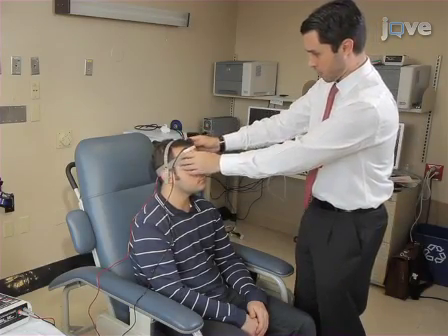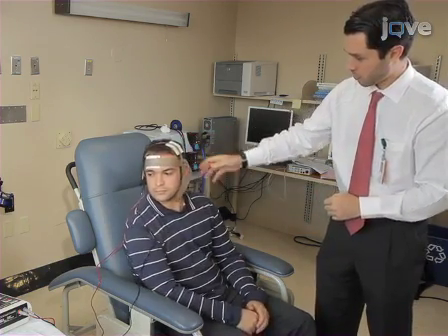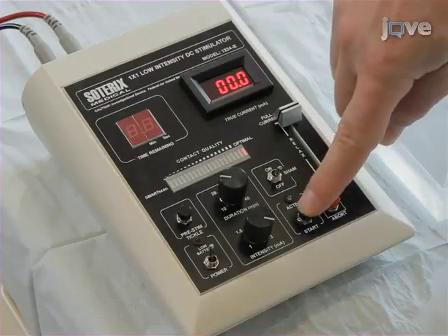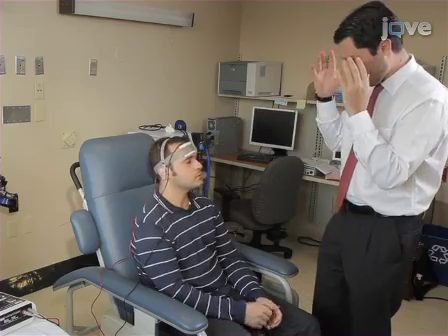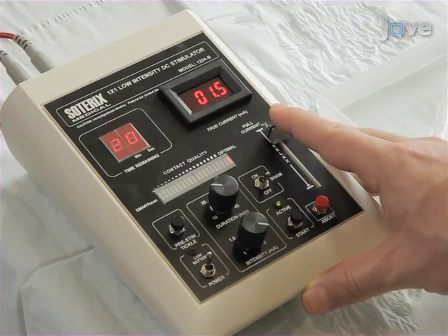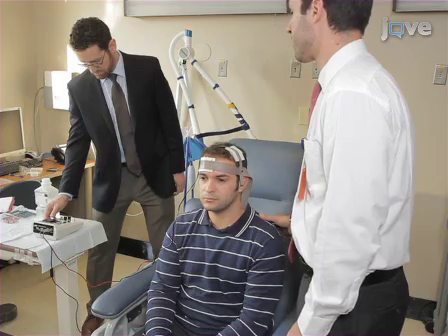Before beginning the experiment, assure that the subject is comfortable and instruct him or her to remain relaxed and awake during tDCS. This will avoid interference, since intensive cognitive effort unrelated to the target area, as well as activation of the motor cortex via prolonged muscle contraction, has been shown to modify the effects of tDCS. Now, initiate the tDCS by pressing the Start button. To reduce any adverse effects, start by ramping up the current flow. At the beginning of stimulation, the majority of subjects will perceive a slight itching sensation, which then fades in most cases. Some subjects may experience discomfort during the initial tDCS period; in such cases, the current may be moderately decreased by 50% temporarily as the subject adjusts, then gradually increased back up to the desired level.